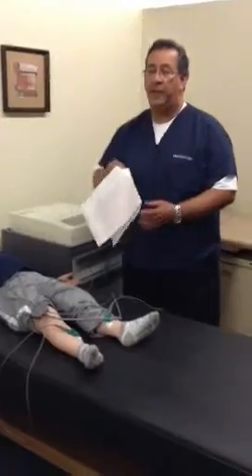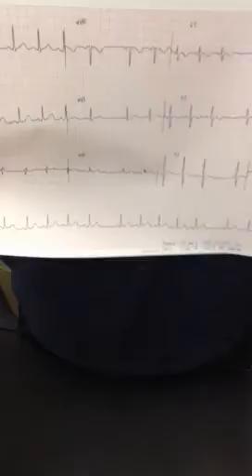So I'm going to show you what had happened. The patient actually moved on the first tracing, but didn't move too much on the second tracing. If you notice right here, there are some fuzzy lines which are not really straight. But look at this same area in line two — it's very clean and straight, and that's where the patient was actually holding still. This machine is very sensitive. It's picking up the heart's muscle electrical activity, but it can also pick up muscle movement from other parts of the body, so we need to be really still during the procedure. The patient cannot move — they can't be tense, in pain, cold, or just uncomfortable. Those are things that can cause what we call somatic tremors. This is actually an example of somatic tremors.